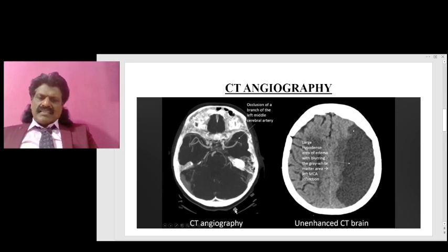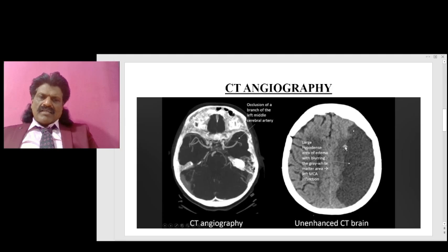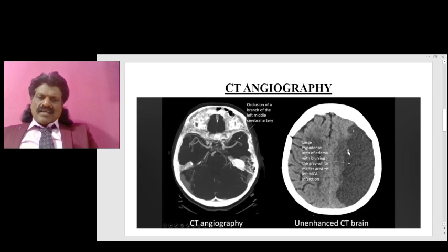Here you can see on the normal side the gray matter and white matter are well differentiated, but on the infarcted side the gray-white matter distinction is lost — there is blurring due to cytotoxic edema. This is the MCA infarct which has resulted from the occlusion of the MCA vessel.